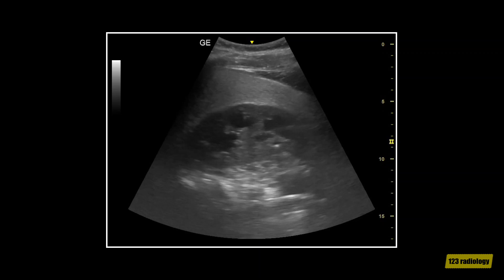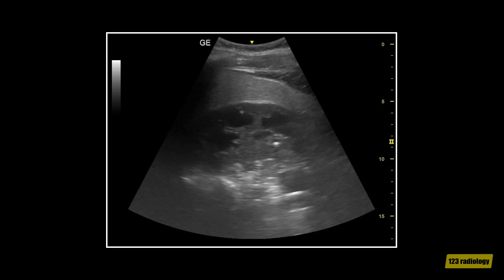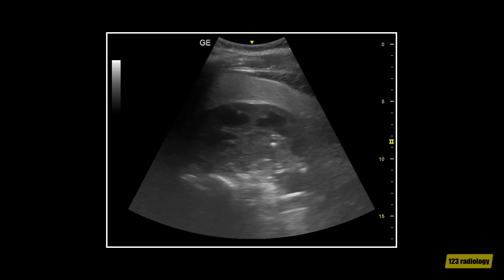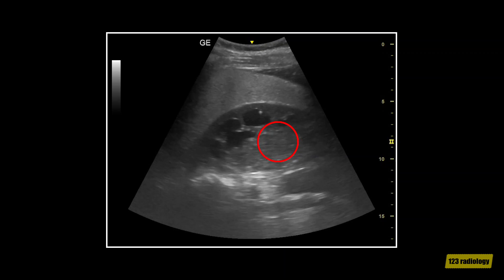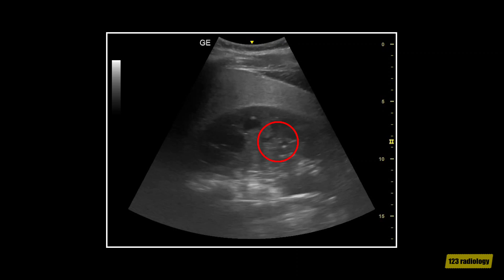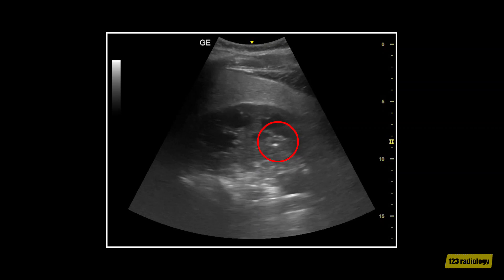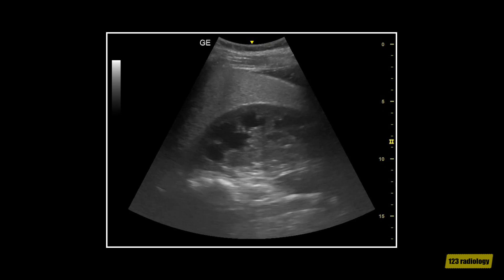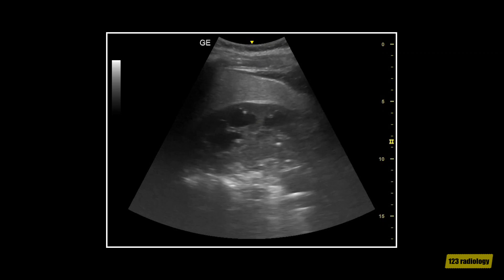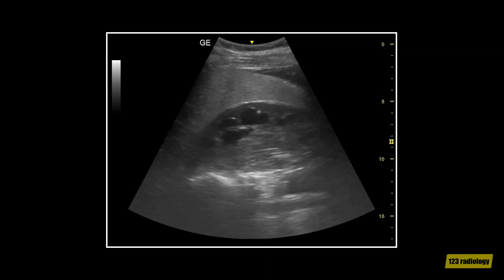This is a longitudinal view of the right kidney in the same patient. It shows a renal stone. Horseshoe kidney can be complicated by hydronephrosis and stone formation.